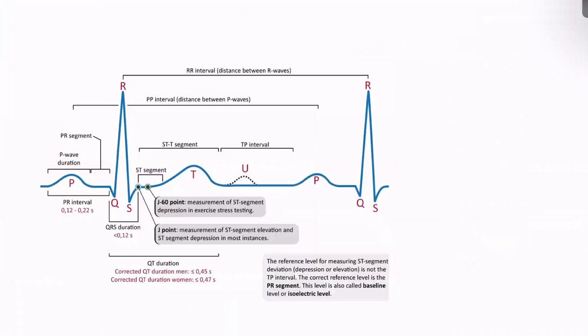Okay, so that is the background of ECG. After that, I'm going to talk about the terminology of the ECG. When we talk about ECG, we are going to say wave, complex, segment, interval, like that.